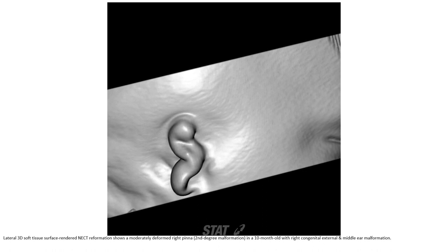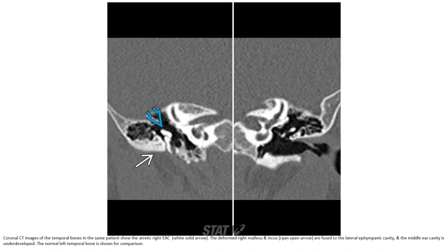In a 10-month-old patient presenting with external and middle ear malformation, this is a coronal CT image of the temporal bone. In the same patient, note the narrowed external ear canal. The deformed malleus and incus are fused to the lateral epitympanic cavity, and the middle ear cavity is underdeveloped. The normal left temporal bone is shown for comparison.